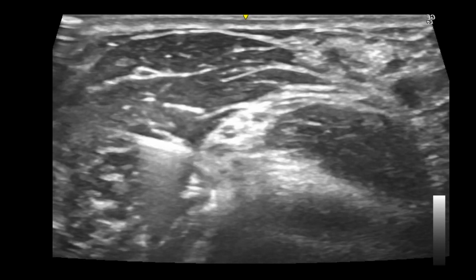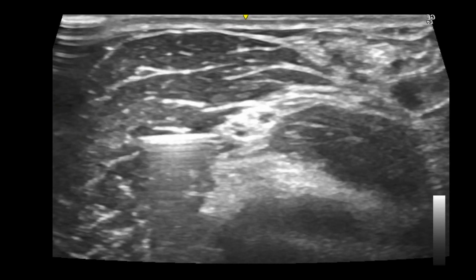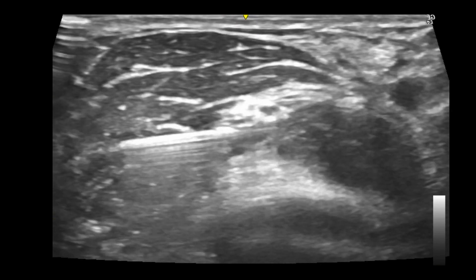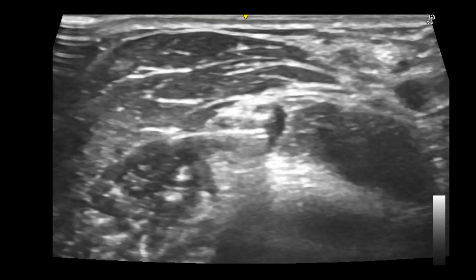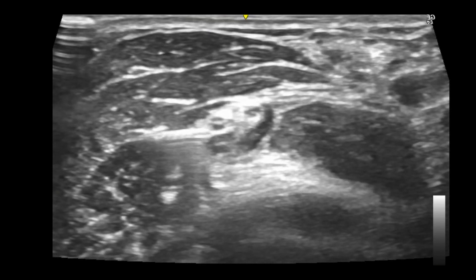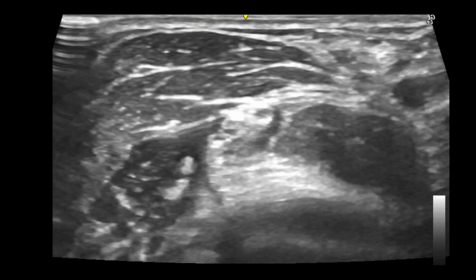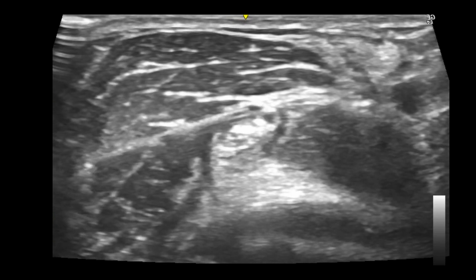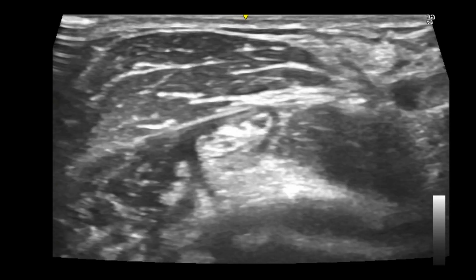Small injections of local anesthetic are given there. You can see the pressure head of local anesthetic now surrounding that nerve. A small extra injection, and there you go — the radial nerve is completely surrounded too.